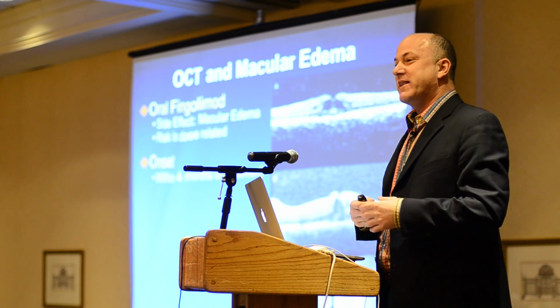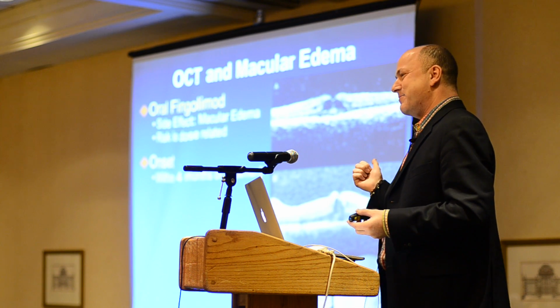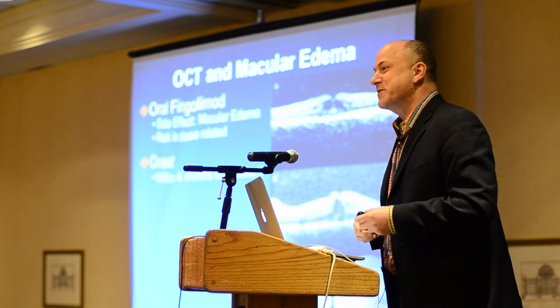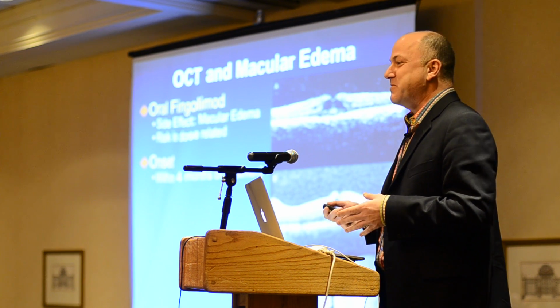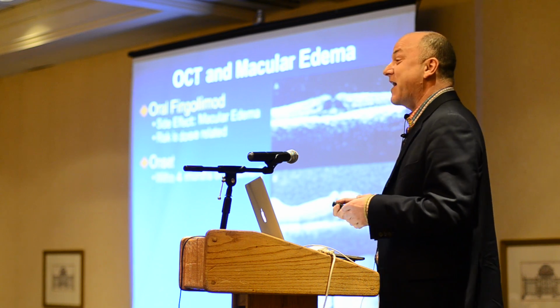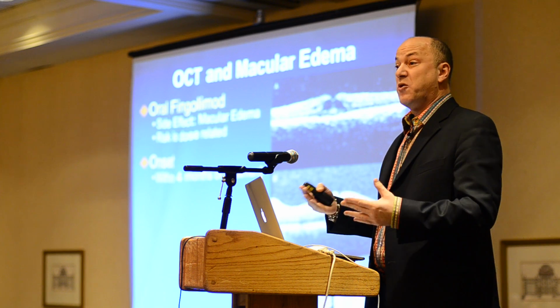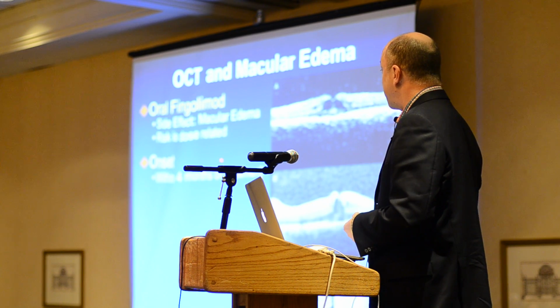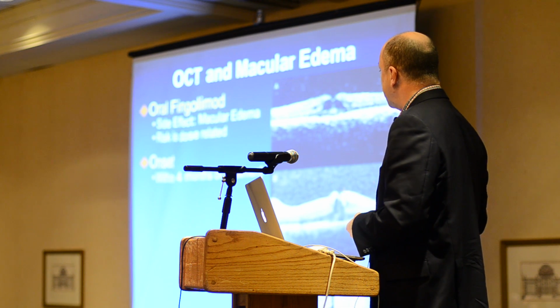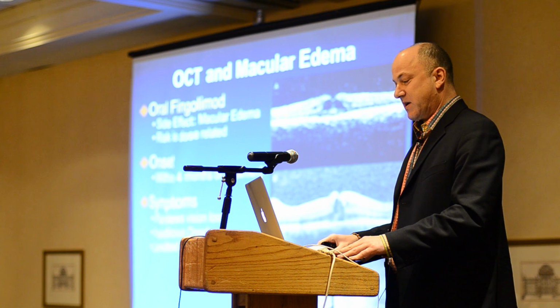So sometimes I'm reporting back to your doctors, hey, did you bother to take a look or send this person to an ophthalmologist, because they've got a problem going on in their retina that's a little bit more important than just whether they have swelling. The second is we know that if you have inflammation in the eye or have other conditions like diabetes, you may be more predisposed to this complication, and we can detect those problems with the OCT machine.